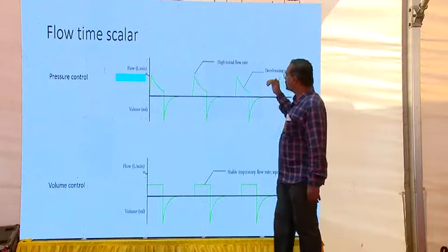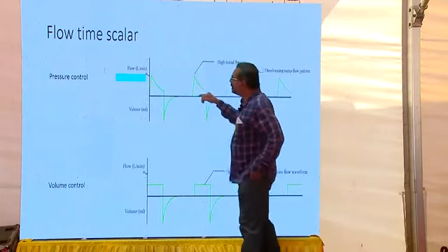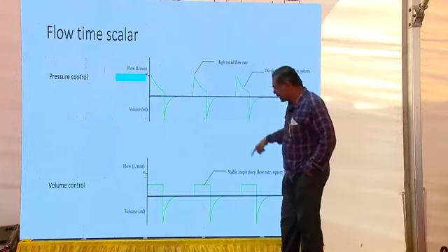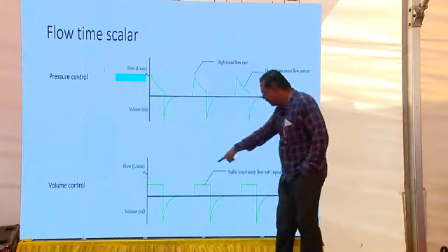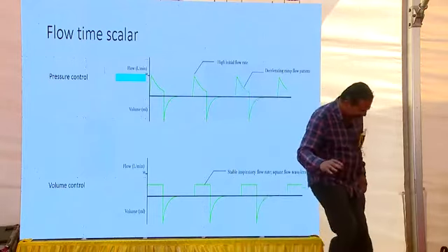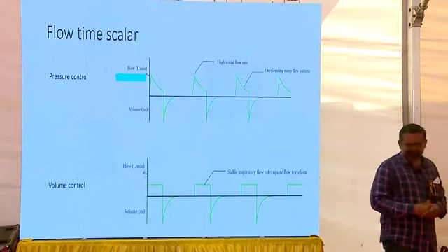So with volume, what happens? This pressure, this PIP, rises and then comes down, ramp-like, and this volume is actually square. So what is the summary? Because many times these graphics are very difficult to understand sometimes.